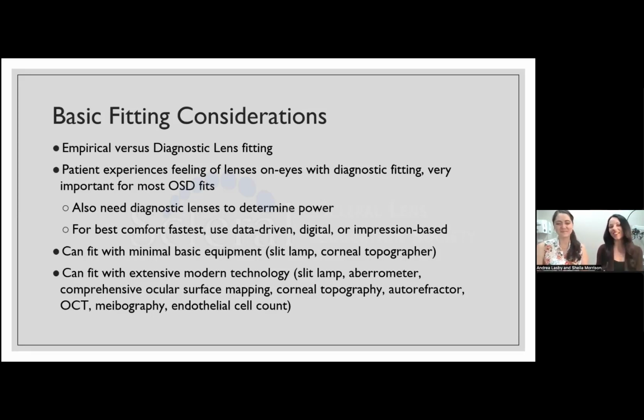Yeah. Oh, this reminded me of the other secret weapon. I think actually Dr. Habibi on Try Not to Blink mentioned this. What would you be trapped on an island with, with your sclerals? What would be your one tool? People are saying things like slit lamp, and the one thing we're missing is sodium fluorescein for the old-fashioned way. So that's another tool, absolutely, that you need for doing the fits without the tech. Yes, absolutely. Which we all have in the office.